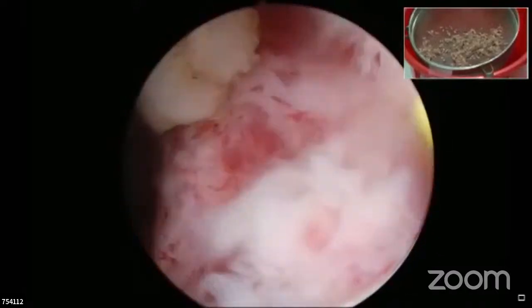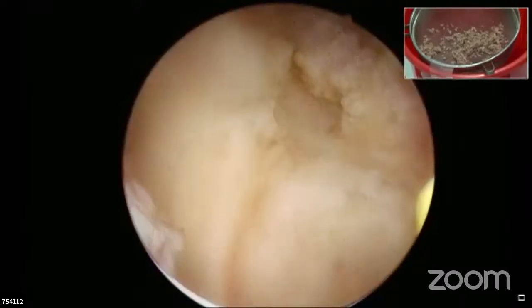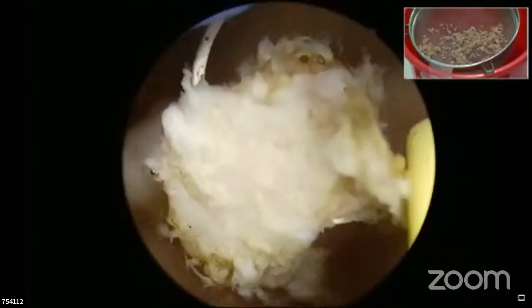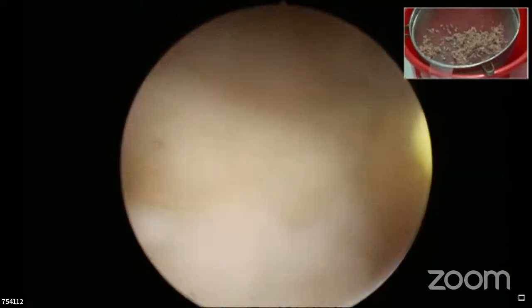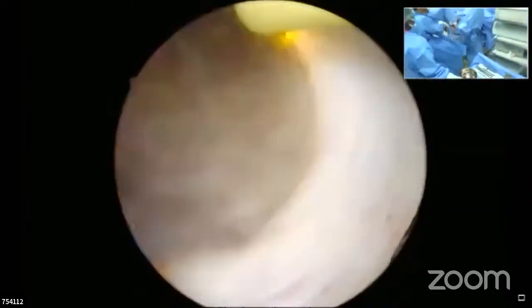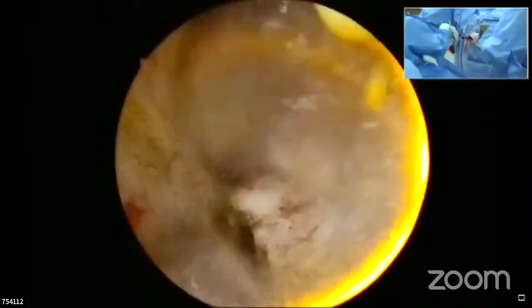Dr. Gupta, there's a question. What about the 22 French TURP sheath? Your take on that, and if you have experience, can you share with us? No, I use 26 French. If there is any doubt about the meatus, I do Otis urethrotomy, and I found that after using Otis urethrotomy, the incidence of this stricture is much less.